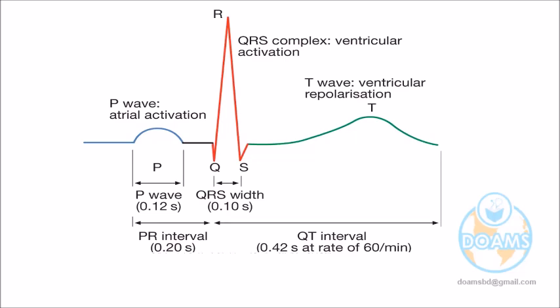CQT, corrected QT interval, where we are correcting for the influence of other factors. So one important factor of the QT interval is the rate, the heart rate.